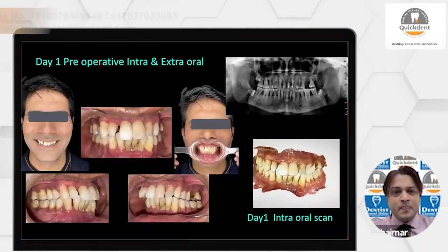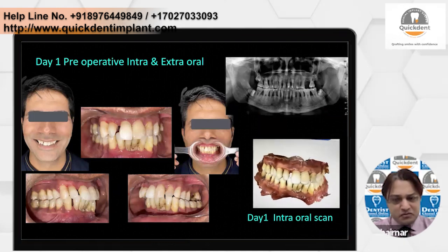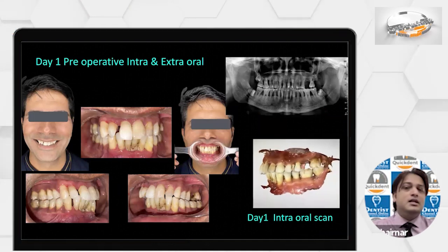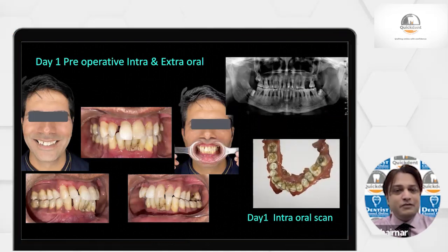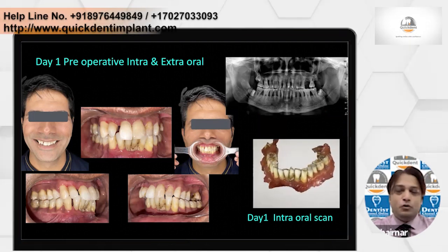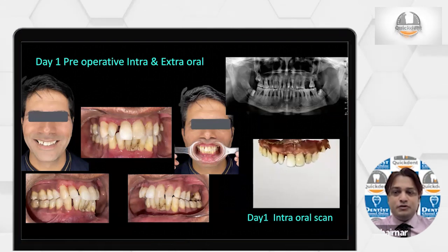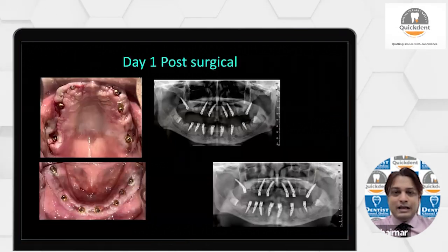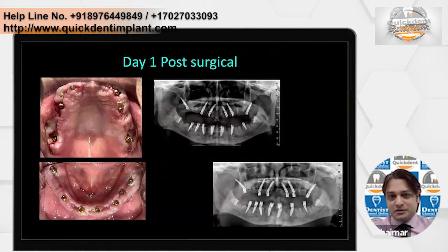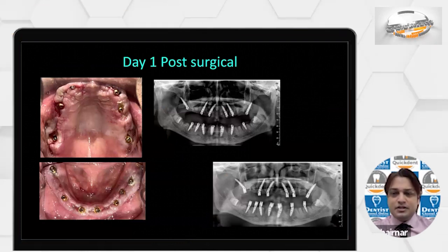Let's see. Okay, now suppose something similar, a patient with periodontally compromised dentition, a lot of teeth were mobile and having deep pockets, so we decided to go for total extraction. So on day 1, what we do now is we do complete intraoral scanning, upper and lower jaw with the bite, everything is done. Now we go for surgical extractions. Okay, we extract and we place the implants, multi-unit is attached, everything is okay.